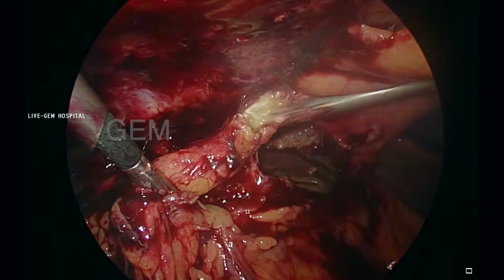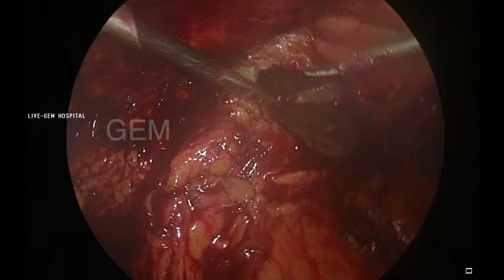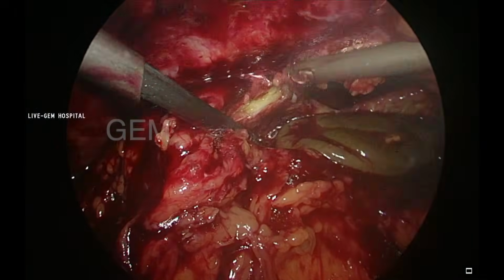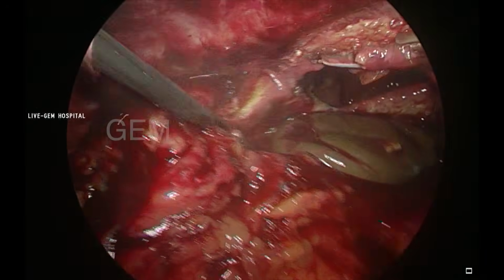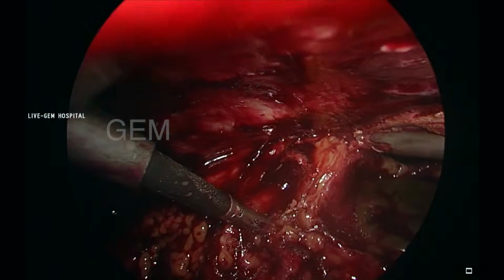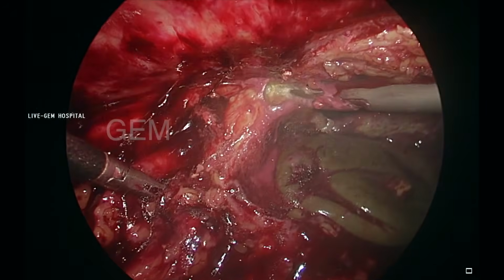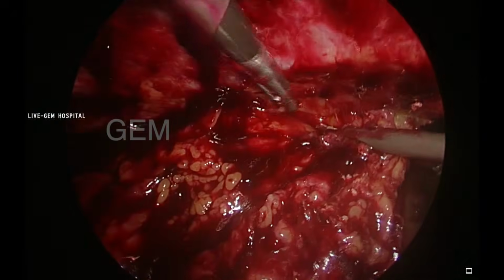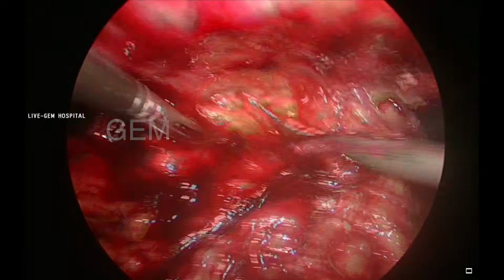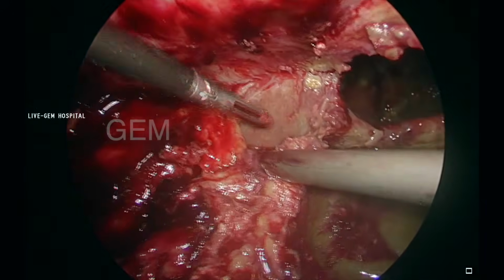This is a very dense adhesion. That's why it is not a perforative peritonitis. It is not a diffuse peritonitis. It is concealed because of this omental seal to the liver and the abdominal wall. So it is protecting against such a bad infection. It is not spreading to any other quadrant of the abdomen.